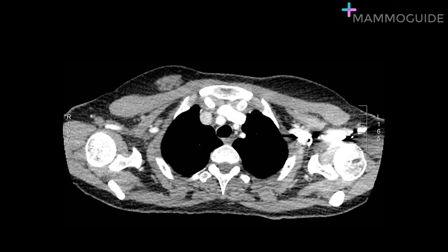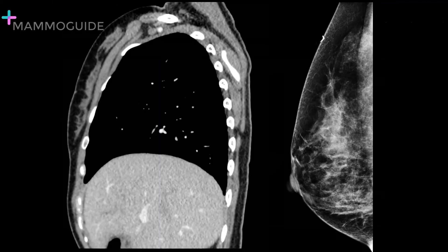Here's an example of a CT scan where a mass was commented on in the right breast. The patient was sent for mammographic evaluation, and on the mammogram, this turned out to be simply an island of normal breast tissue. If the radiologist had originally performed sagittal reformats of the breast, they would have seen this looks like just a clump of normal breast tissue, and perhaps the diagnostic evaluation could have been avoided.